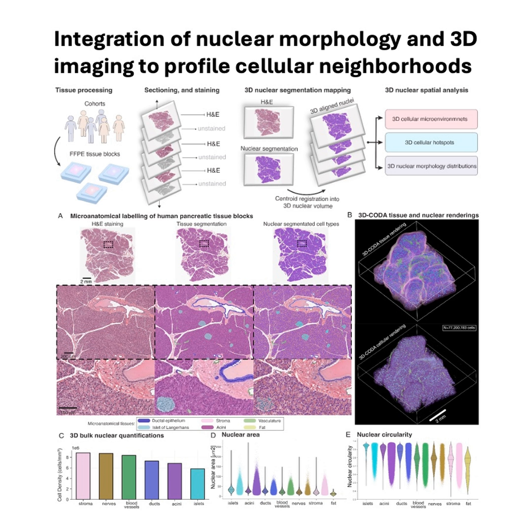And did the nuclei look different too? Oh, absolutely. Huge variations in nuclear morphology depending on the tissue type. For instance, the nuclei in the islets of Langerhans tended to be very circular, almost perfectly round on average. Okay. They showed considerable variation in their size, their area, some bigger, some smaller within the same islet. Right. And they had the largest average nuclear area overall.